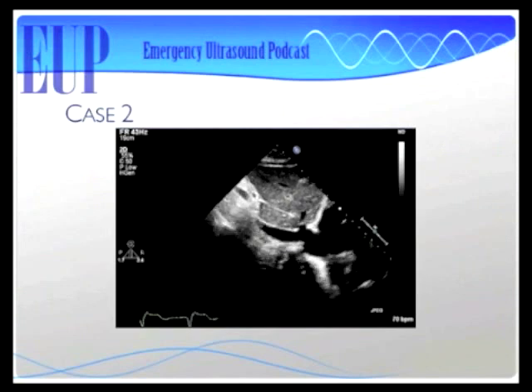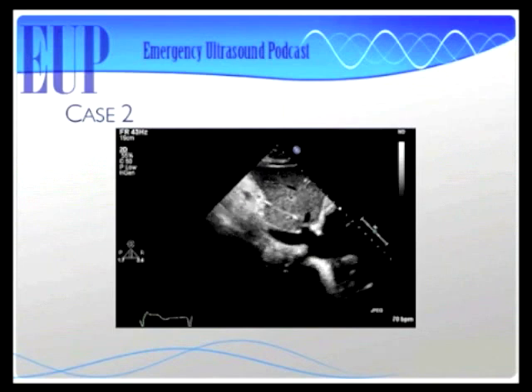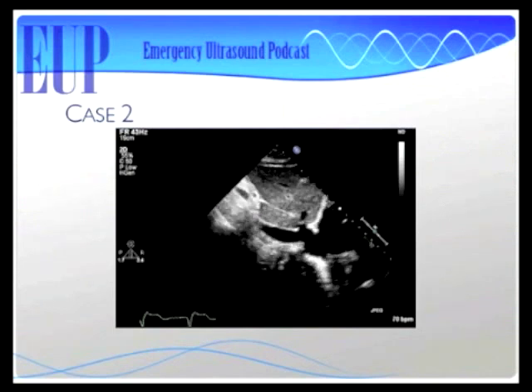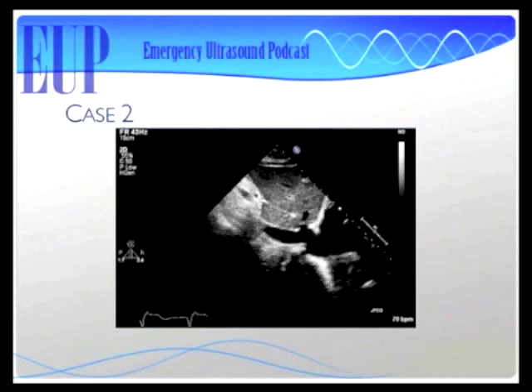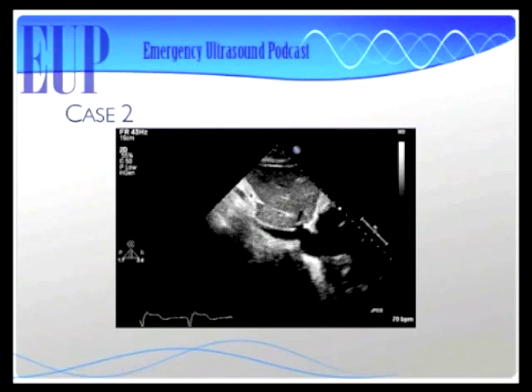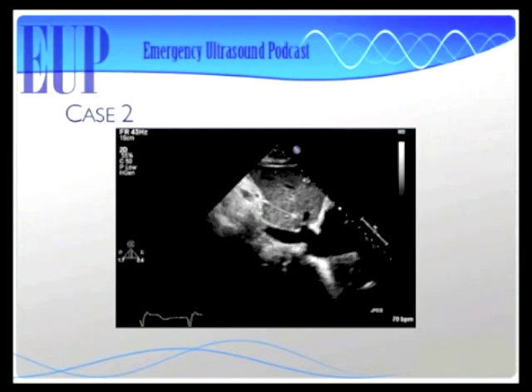Yeah, so not super small and doesn't completely collapse on itself, but it's probably around 50% or so. I'm not sure exactly what the CVP is on this patient, but it doesn't look really overloaded. This one isn't obvious. You said if it's distended and not collapsing at all, high CVP. If it's collapsing completely, low CVP. I guess this is in the middle. Yeah, I would say it's in the middle too. So I guess it's normal. Okay, all right, so we're going to go with normal.